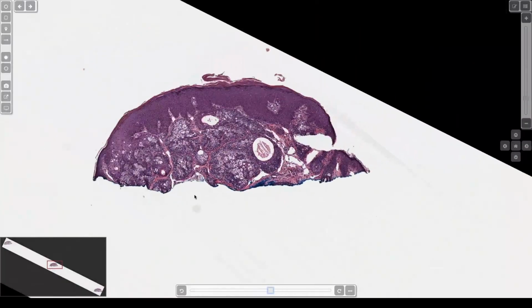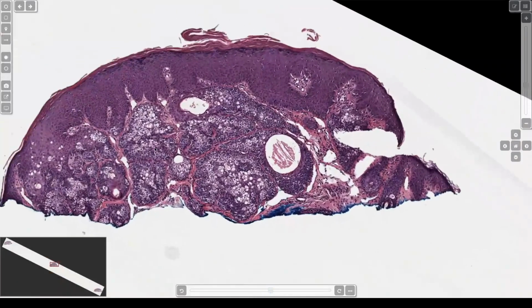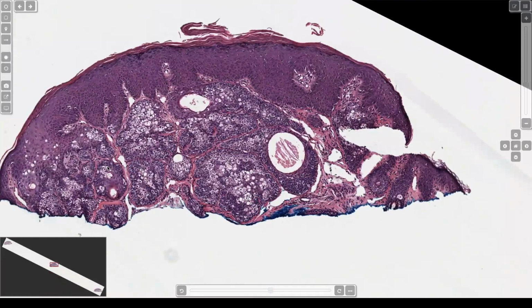So what kind of a little nubbing are we dealing with here? It's like a little bump on the face. You can tell anytime there's a little dome with a flat, it's almost always a bump on the nose, and they thought it was a basal cell, like every time, right? Yeah, it's something sebaceous. So then we got to decide where.